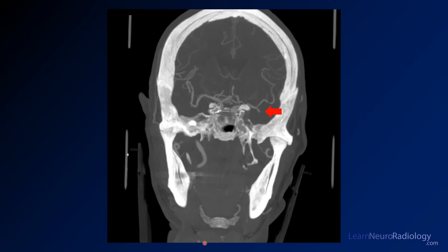Here you see the CT angiogram images. This is the left MCA — you see there's some irregularity of this branch that turns superiorly, and then you also see abrupt truncation of this branch. You see asymmetry here — this is the companion branch on the other side — and there's an occlusion, which is what's causing the ischemia.